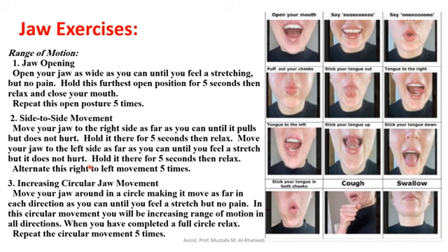Then move your jaw to the left side as far as you can until you feel a stretch but it doesn't hurt. Hold it for 5 seconds, then relax. Alternate this right to left movement 5 times. Increasing circular movement.